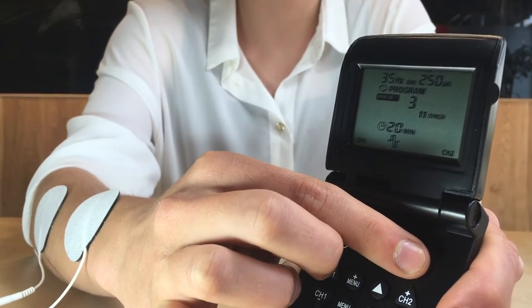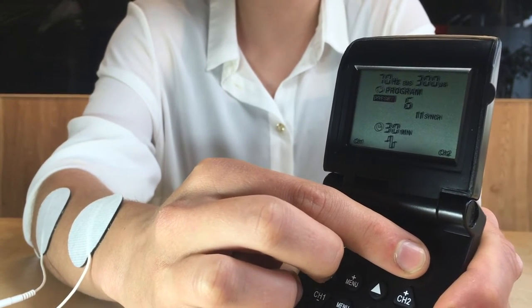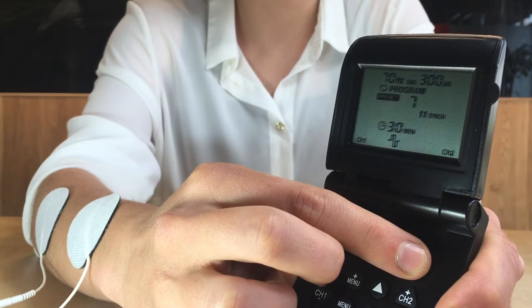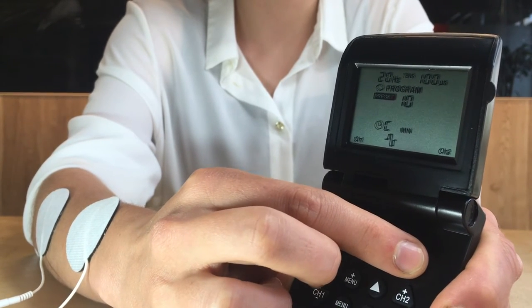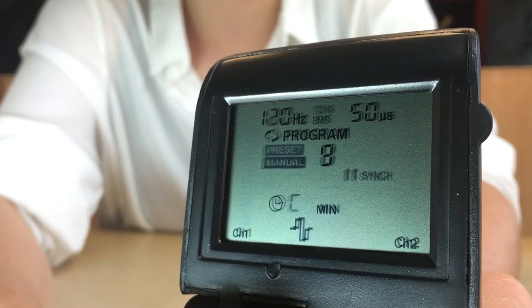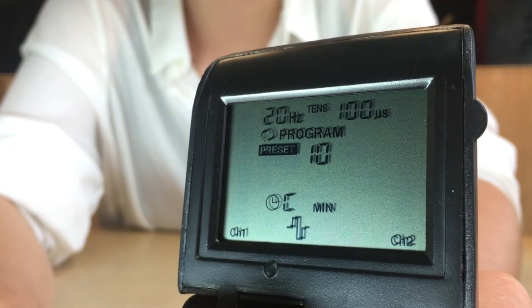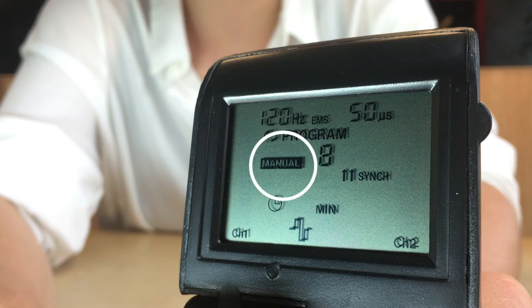On the MK3, all programs are pre-set, except Program 8, which is a manual EMS program that has the ability to be individually set as per your doctor or therapist's instructions. Generally, your doctor or therapist will advise you on the program to use for your condition. It will either be one of the pre-set programs, or they may pre-set the manual program to specific settings for your condition.